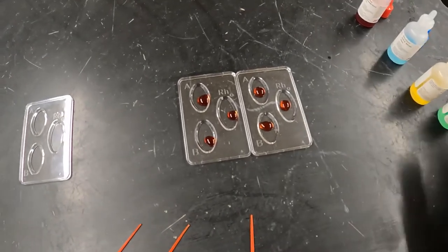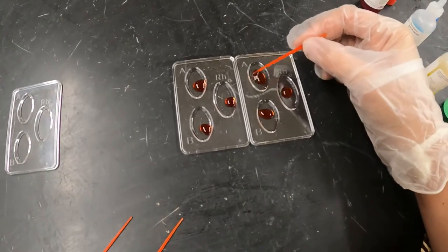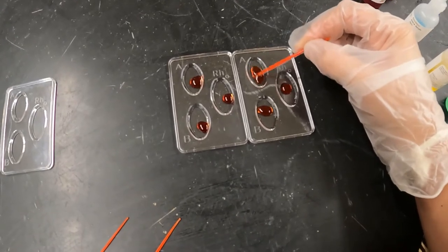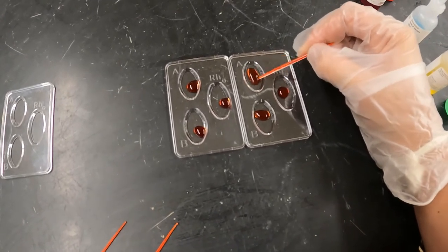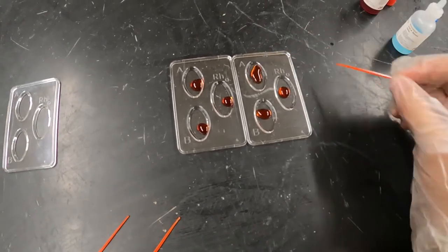And then you're going to use a separate toothpick for each of them to mix. And the idea is that if it starts to coagulate or mix together, you might see a color change, you might see it start to clot up, and that's what we're looking for. So I'm going to mix for a few seconds for A.